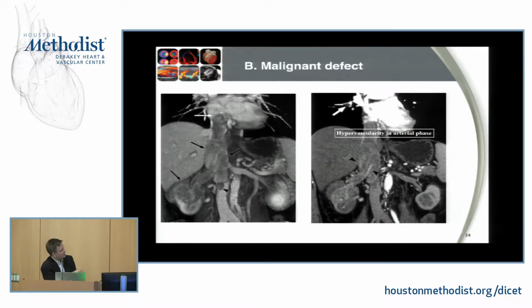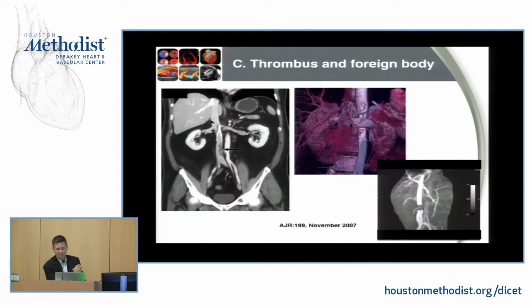Malignant defects, fortunately, are uncommon, but when they come up are pretty dramatic. And to see those and be able to differentiate that from benign thrombus or bland thrombus, really important to us because obviously the approach is totally different. And to go into thrombolysis and stent this is obviously a great mistreatment of this patient.